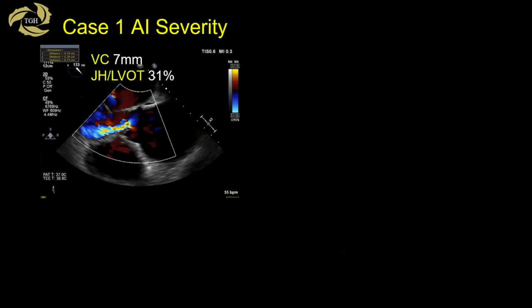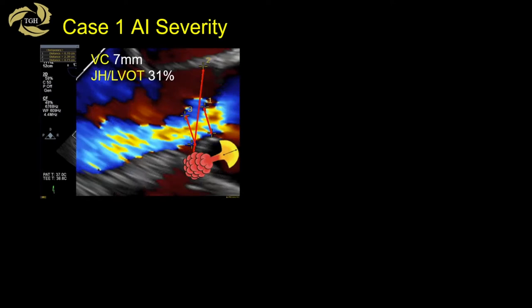When grading AI severity in this case, we look at vena contracta width and jet height to LVOT ratio. It's important to know the technical nuances when assessing these jets. Zooming in, you can see three components: the proximal flow acceleration, the narrow vena contracta, and finally the jet area. Where and when you measure can be quite variable, so spend time to zoom in and confirm all three components before measuring and quantifying AI severity.